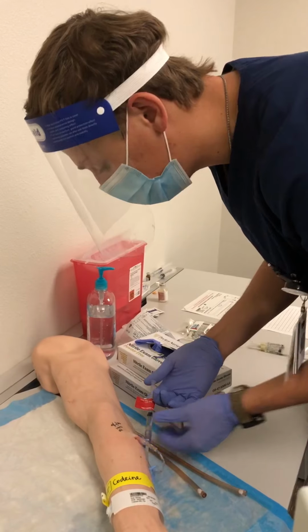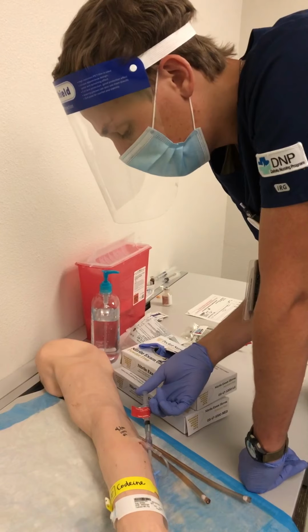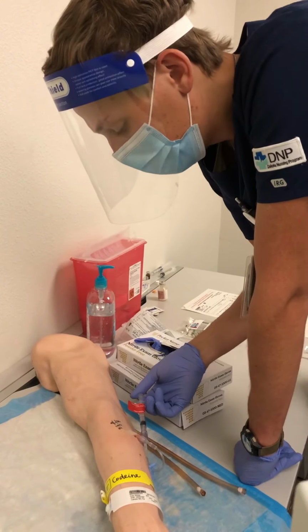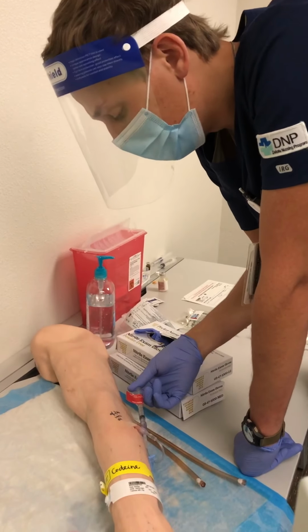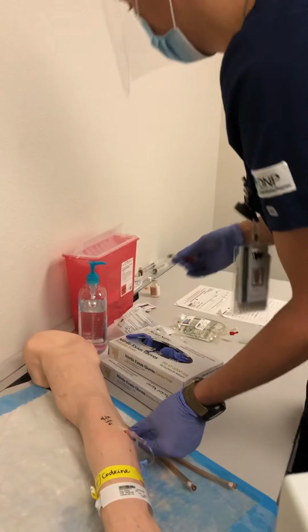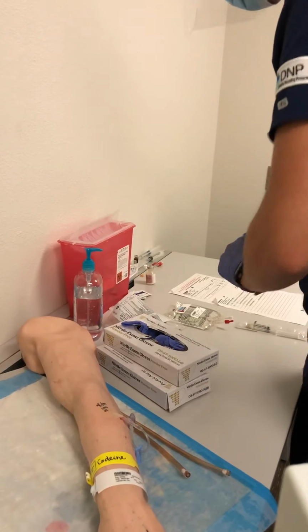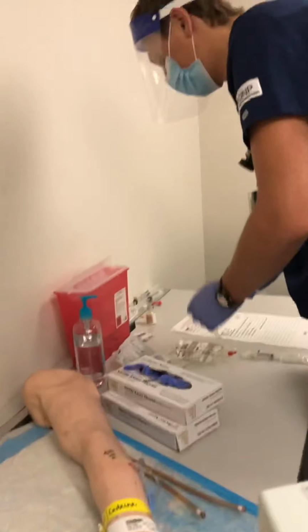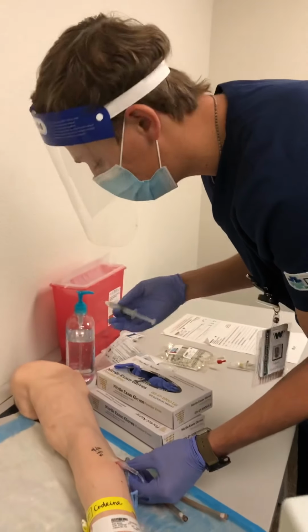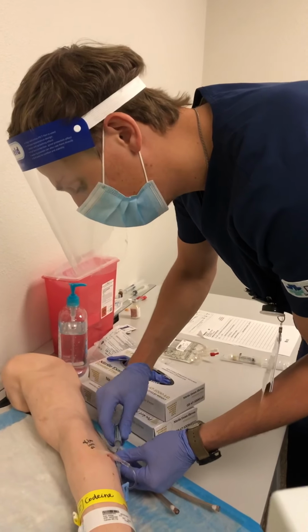And with morphine, you have to push at a slow rate, so this dose I'll have to push over 2 minutes. But for time's sake of this video, I'm just going to administer it normally. But in real life, I would administer it over 2 minutes. Okay. And then this can go into the garbage as well. And then I'll need to flush it one last time. And same thing, since this is sterile and the morphine was sterile, I can just connect these without having to clean my hub once again.